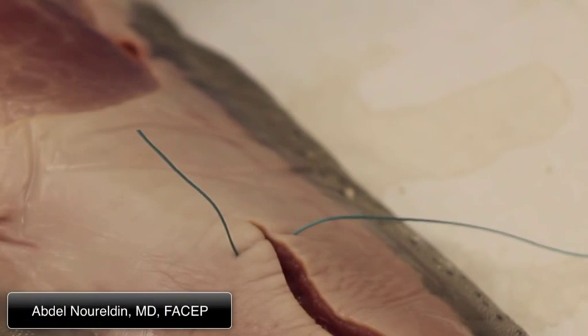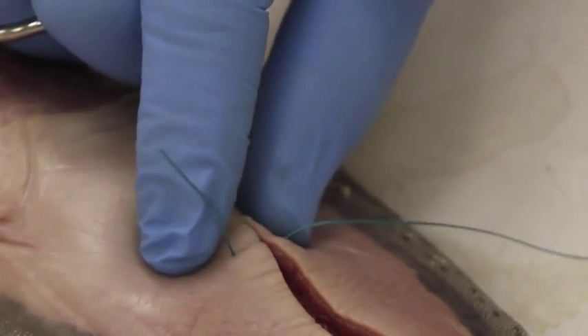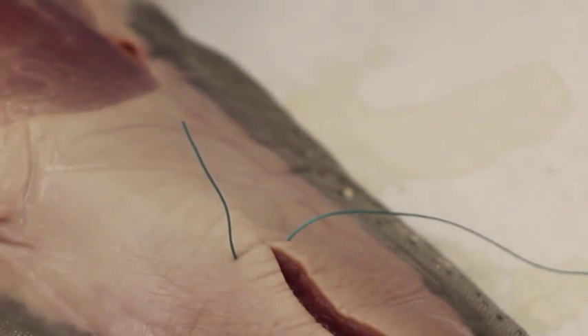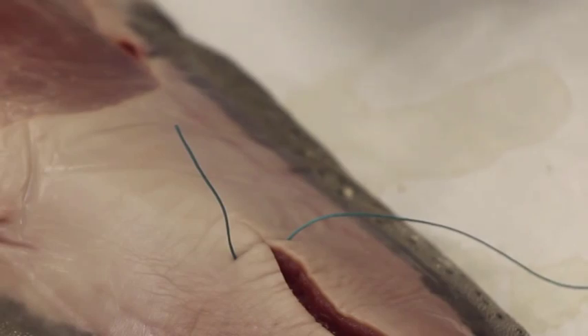We're going to do a slipknot. A slipknot is used to make sure that there is no tension on the edge of the skin — you put just the right pressure on the edges of the skin.